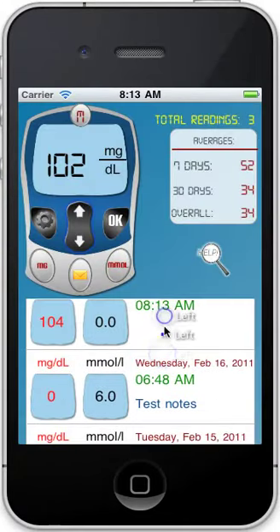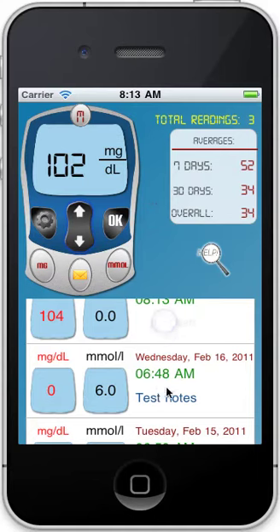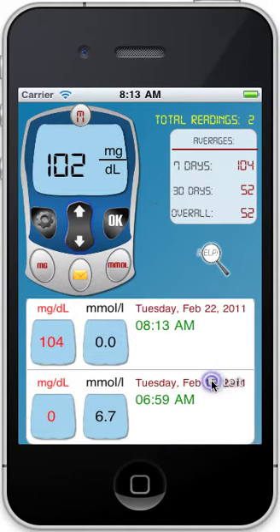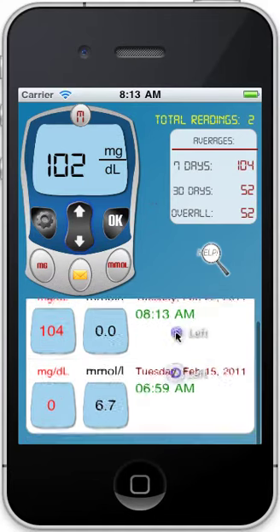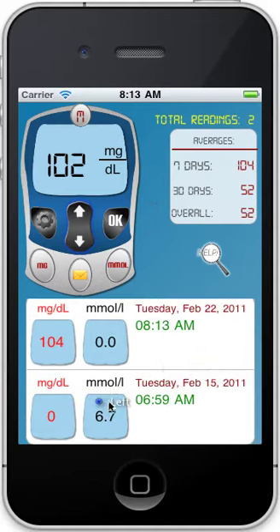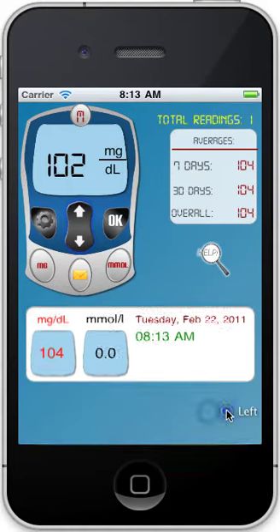I made a few mistakes here. Maybe I want to delete one — I swipe my finger, tap Delete. Swipe my finger, tap Delete. There it goes, and we have the history right on there.